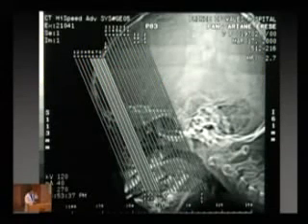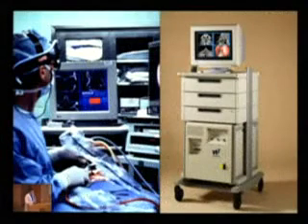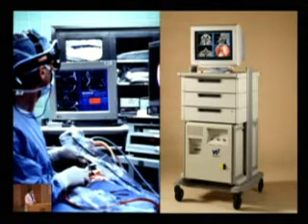In a standard treatment in a hospital, we have done it in 3 to 5 millimeters with a certain degree of overlap. And the area that we overlap is where the key sinuses are draining, between the osteomeatal complex area or the frontal recess area. And that's the area where we need very fine details. And if you are also doing, say, image guided surgery, again, you also need very fine cuts, because in order to reconstruct the tissue planes in all 3 dimensions, you actually need to have fine details.